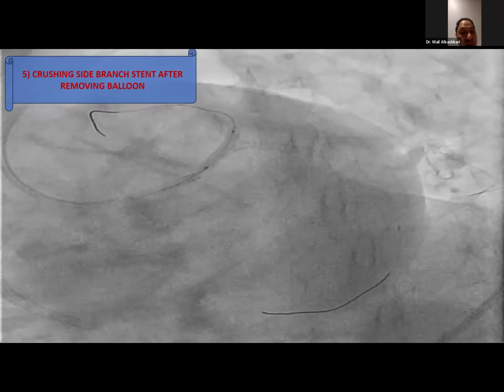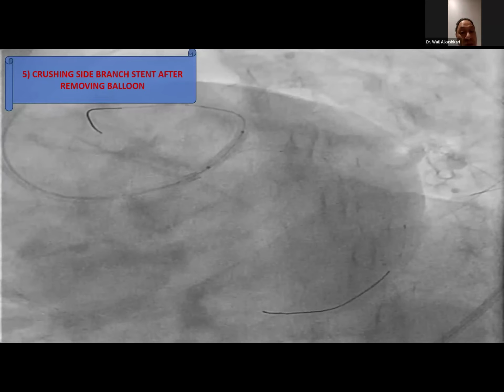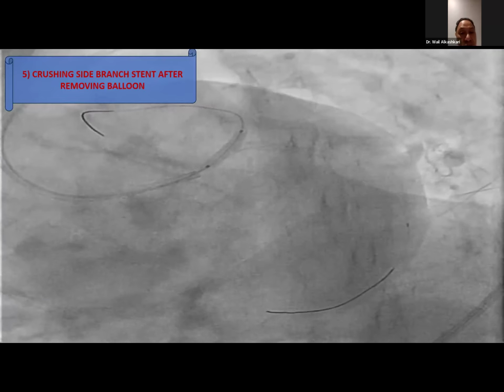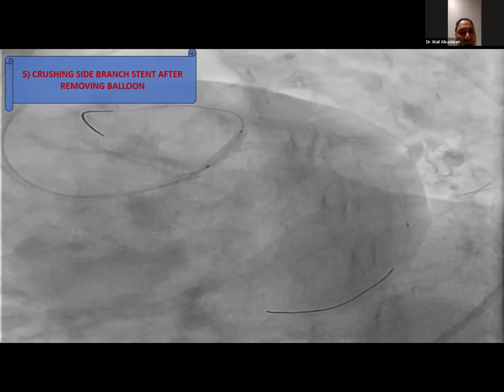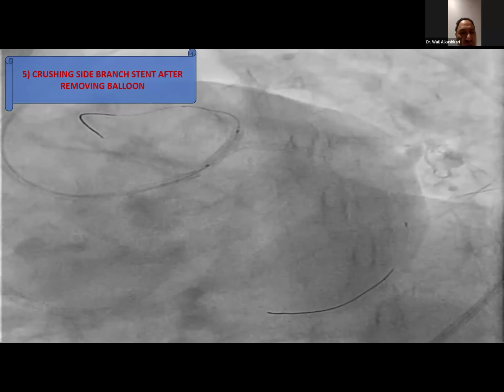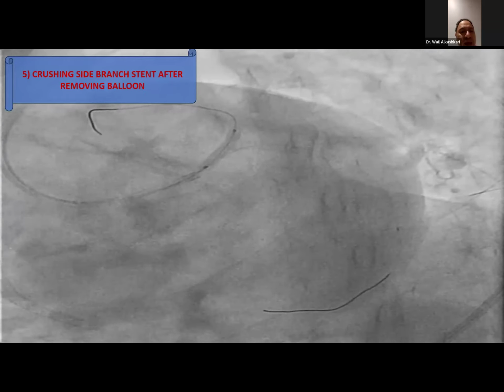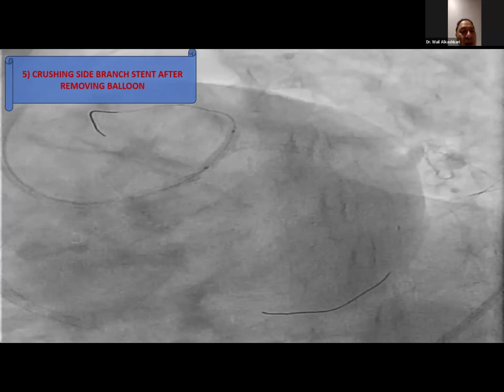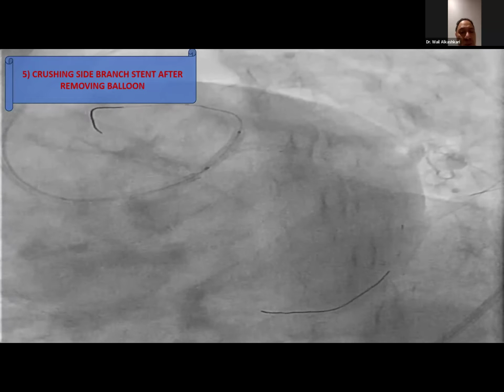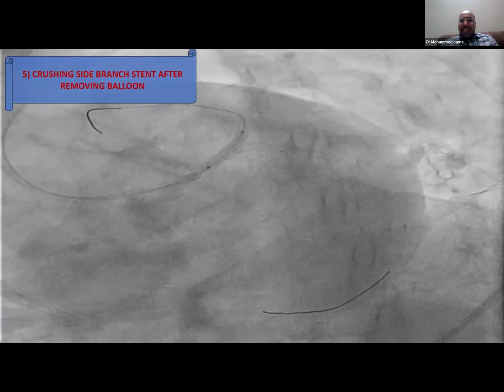It will be difficult to take it out. The other thing is the material covering the stent. It will be slipped out from the wire, it's going to be nidus of thrombus. So even we were in a conference in the EuroPCR, and they did a vote. It's only a minority that leave the wire. So it's always nice to remove the wire. It will not help you in anything if you keep it. Go ahead. You're right. So we will not do this again, inshallah.